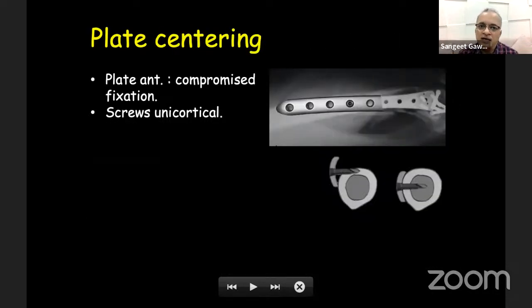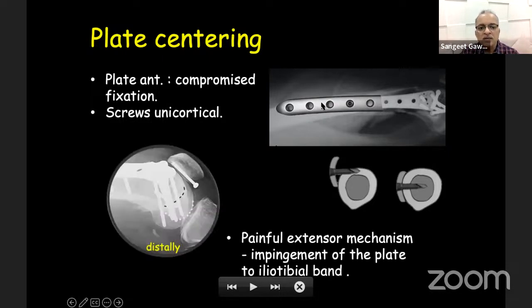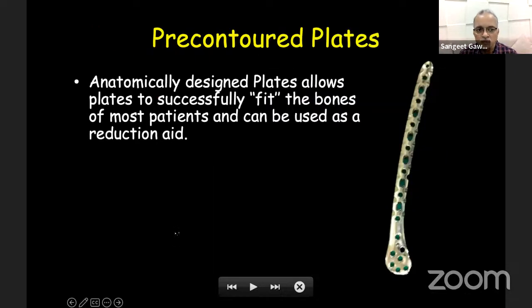Second is a helicopter effect that usually happens when distally the plate is all right in the expected footprint, but proximally it is angulated, and that will give a wobbling effect because the screw is not bicortical, it is not in the center, it is on one cortex, and that will give a poor construct. Similarly, distally, if your plate is too anterior, the extensor mechanism will be impinged, and that will give rise to irritation and restriction of movement.